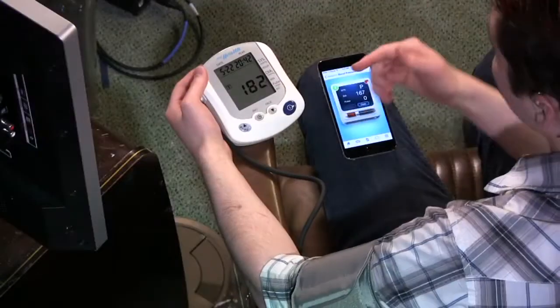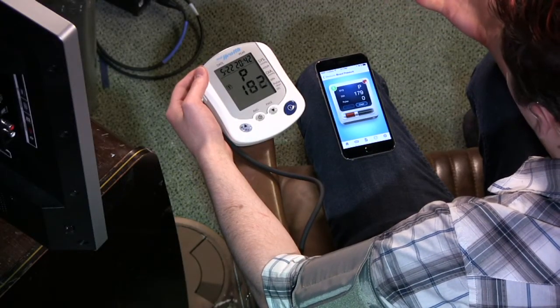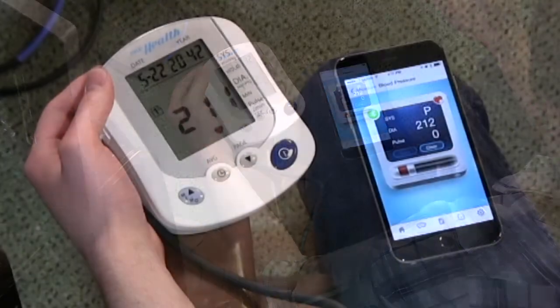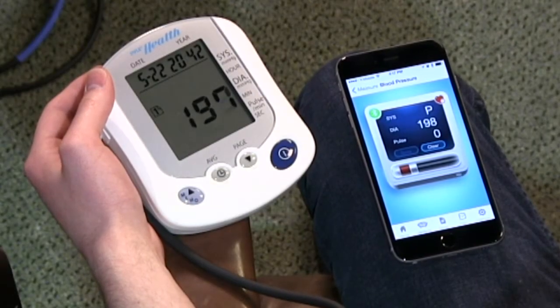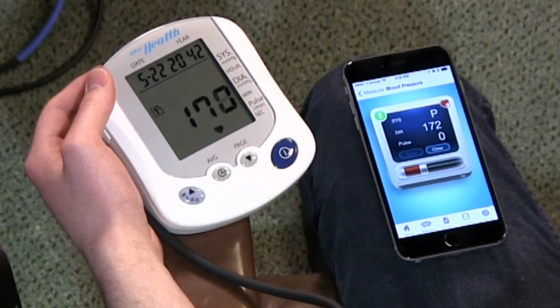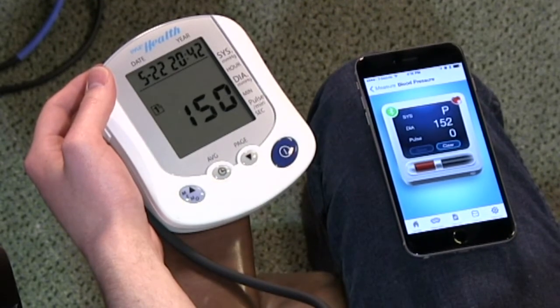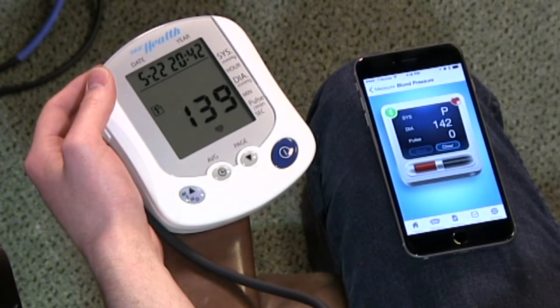This cuff is filled with air. It's doing its job. It's actually filling more with air. It really hurts. You're not supposed to talk when you're doing this, so I may make it a very weird reading. That's okay. They also suggest that you keep both feet on the floor and keep your arm still. There you go, my systolic. And then they're going to do the diastolic, and you're going to get your reading.